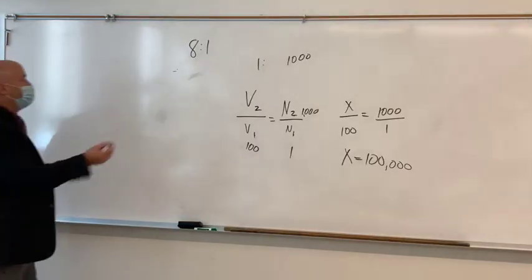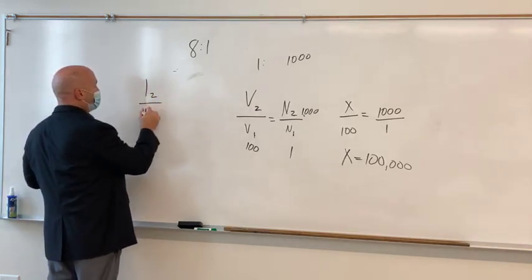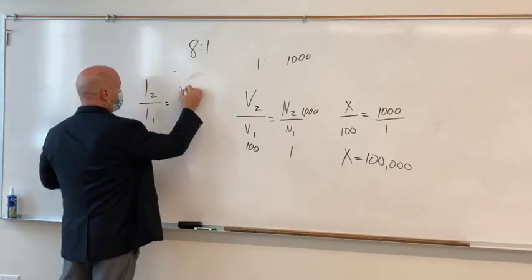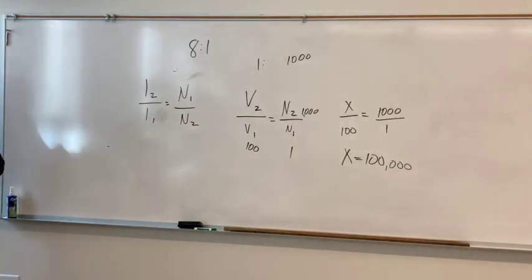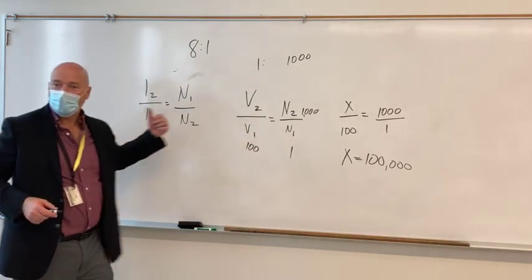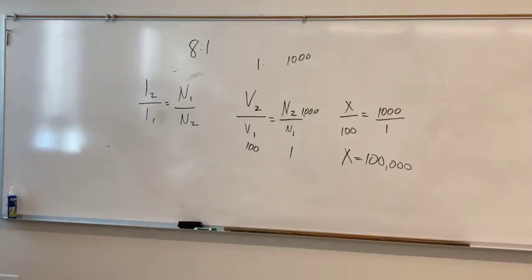So as voltage goes up, what does that say about amperage? It's going to go down, right?